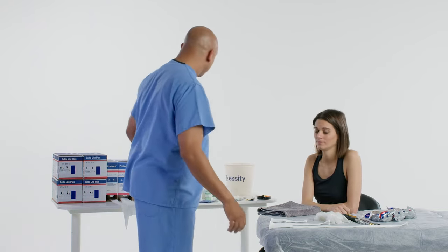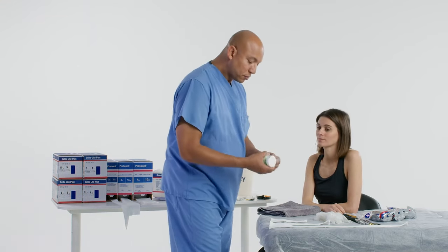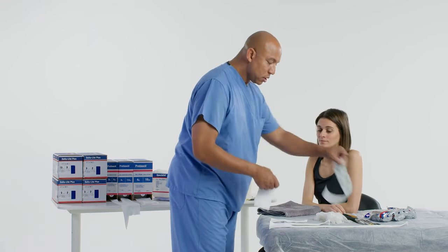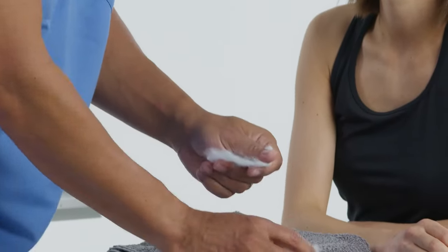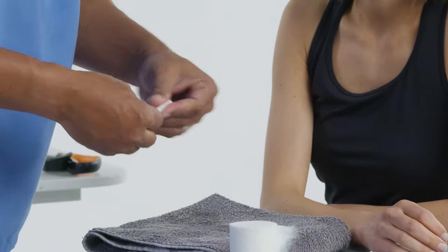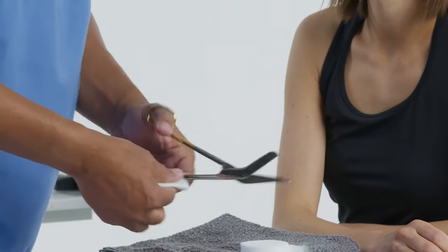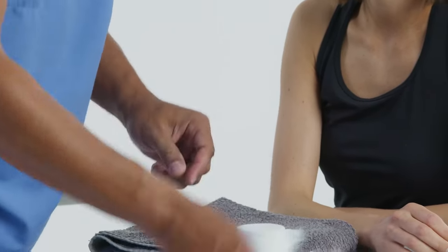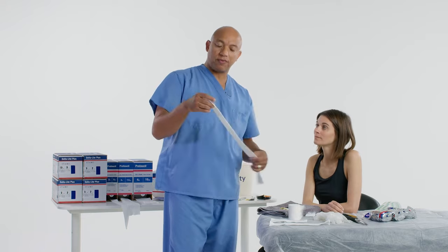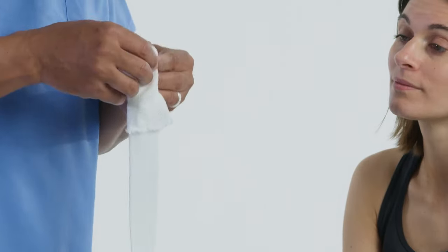On that side of the cast, we want to put some padding between the fingers. The padding between the fingers is going to help prevent maceration of the fingers and also pad the bony prominences between the fourth and fifth finger.